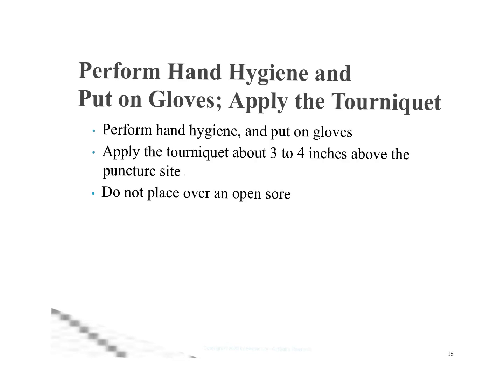Hand hygiene, gloves, and applying the tourniquet. So perform hand hygiene and put on gloves. That should be our first thing. Apply the tourniquet. We're going to go about 3 to 4 inches above the puncture site, and we do not want to place it over an open sore.